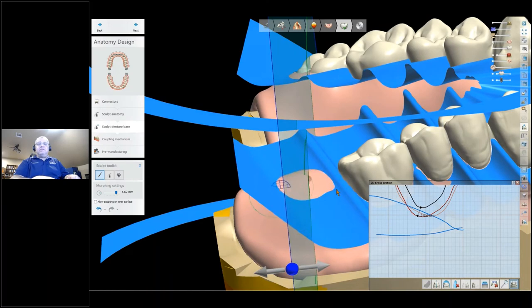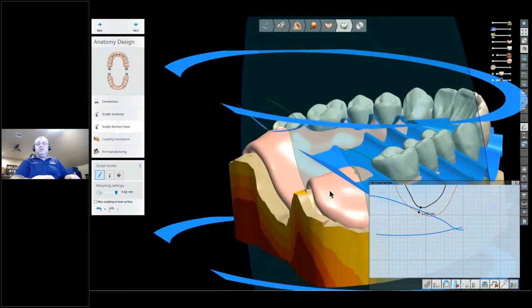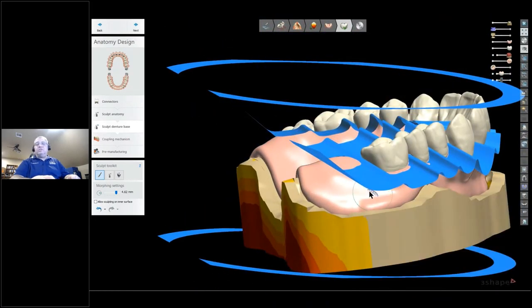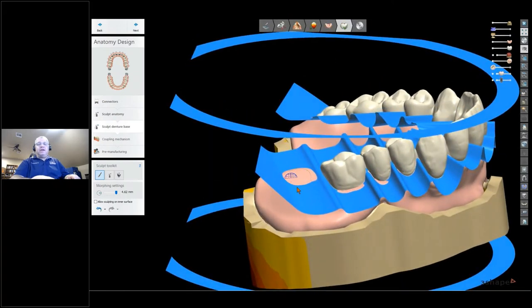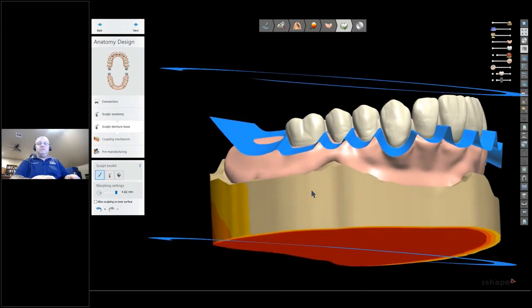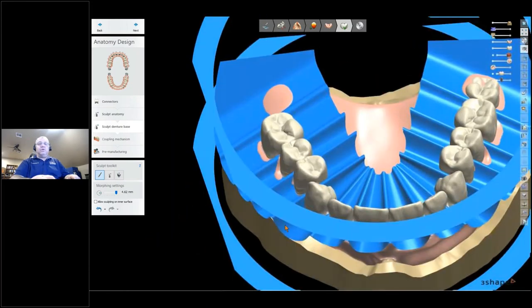That's in an area that's not going to be an aesthetic concern. Or once it's milled, I could come in and take a burr and remove a little bit of that, and then I could use some Pro Base Cold in the same preference shade and put that on top of this and cure it and then polish that off. And then it would again be a pink shade for me. So either one of those options does work here.